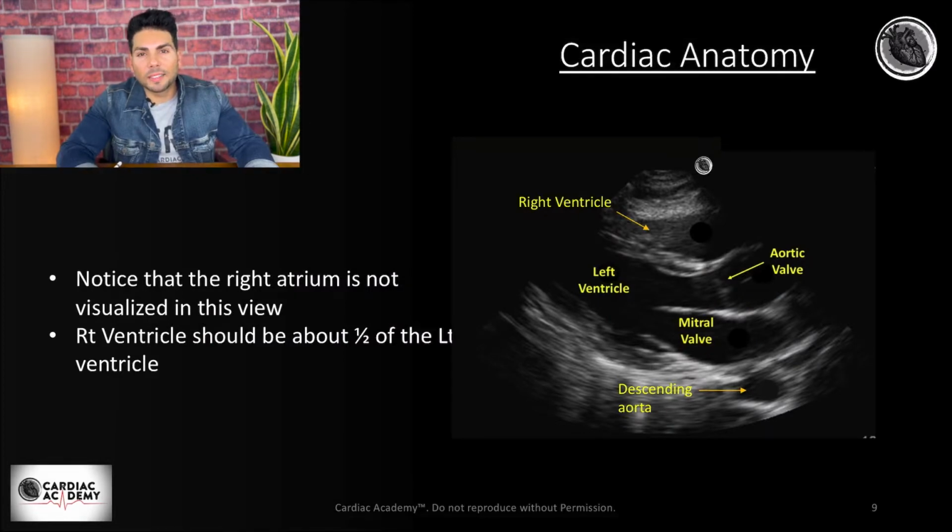Okay, let's talk about anatomy. Whenever you're looking at an echocardiogram, the first thing you should do is try to identify anatomy, right?